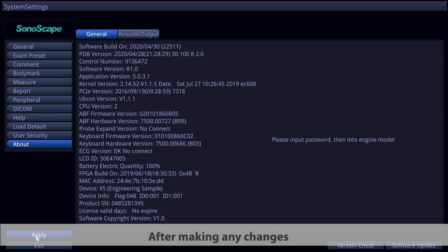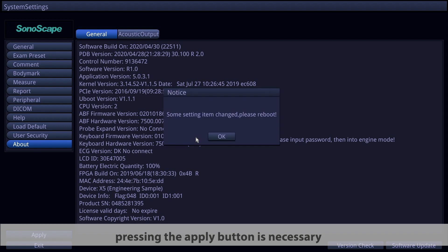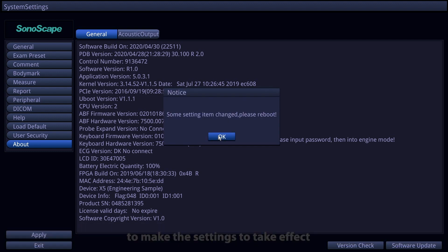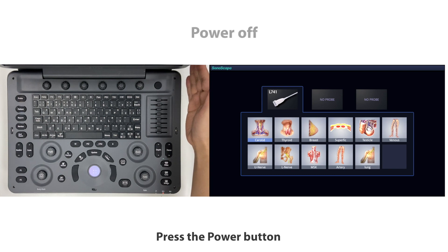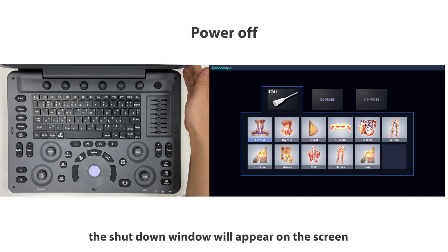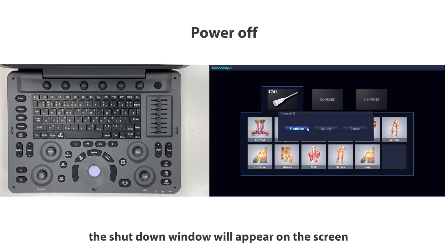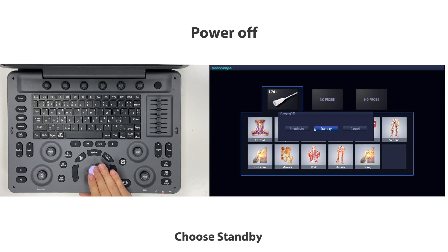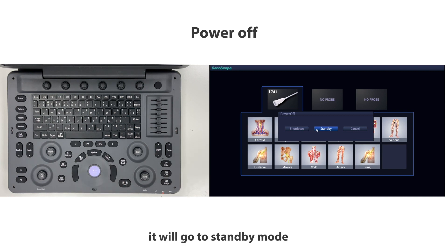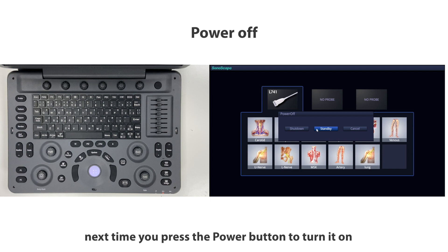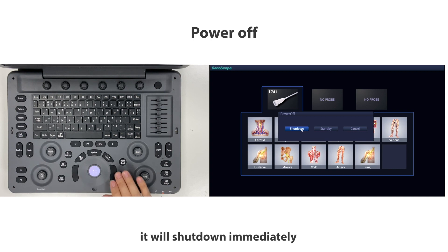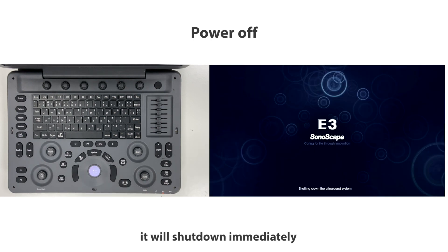After making any changes, press the Apply button to make settings take effect. Press the power button — the shutdown window will appear. Choose Standby to enter standby mode, which will boot up in several seconds when you press the power button again. Choose Shut Down to shut down immediately.